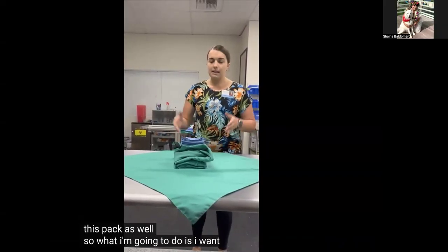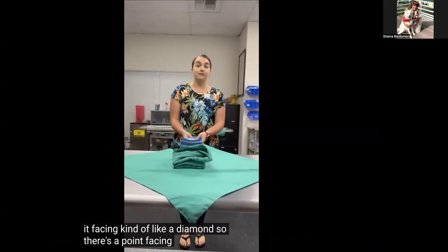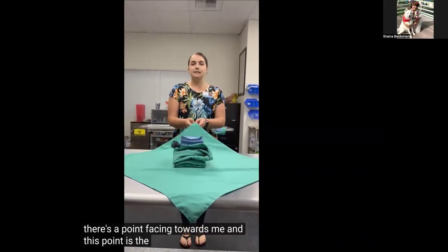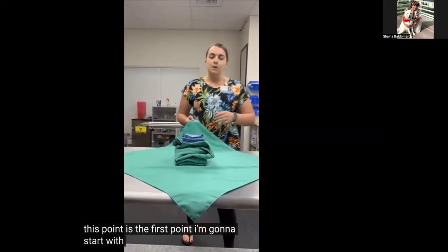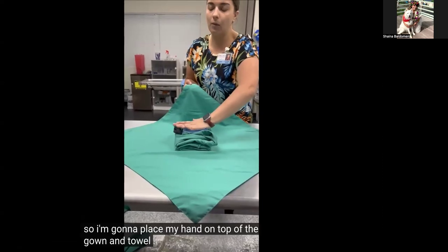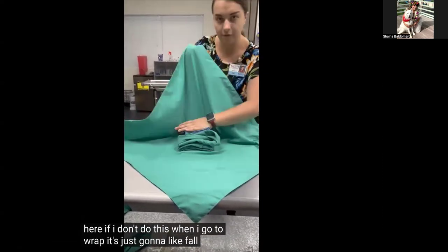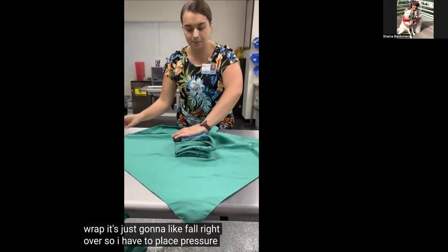So what I'm going to do is I want to put it in the center of my drape, and I have it facing kind of like a diamond. So there's a point facing towards me, and this point is the first point I'm going to start with. So I'm going to place my hand on top of the gown and towel and put some pressure here. If I don't do this, when I go to wrap, it's just going to fall right over. So I have to place pressure here.